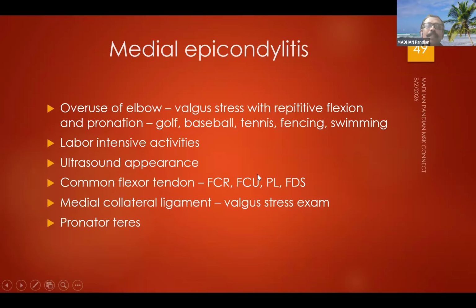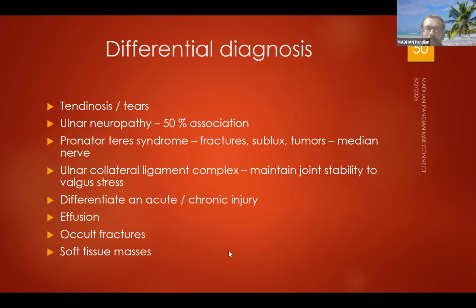Medial epicondylitis, again, is caused by quite a lot of overuse because of valgus stress with repetitive flexion and pronation, in somebody who plays baseball, tennis, golf, fencing, swimming, or does labor-intensive activities. In the ultrasound appearance, you can see some blood vessels, neoangiogenesis, and clinically you can do a valgus stress exam to find out whether there is any common flexor tendon related problem.